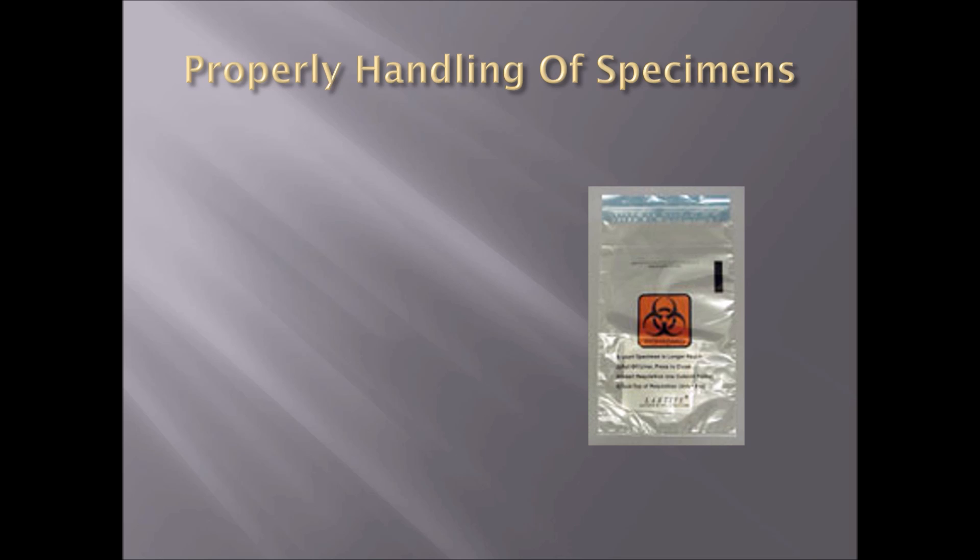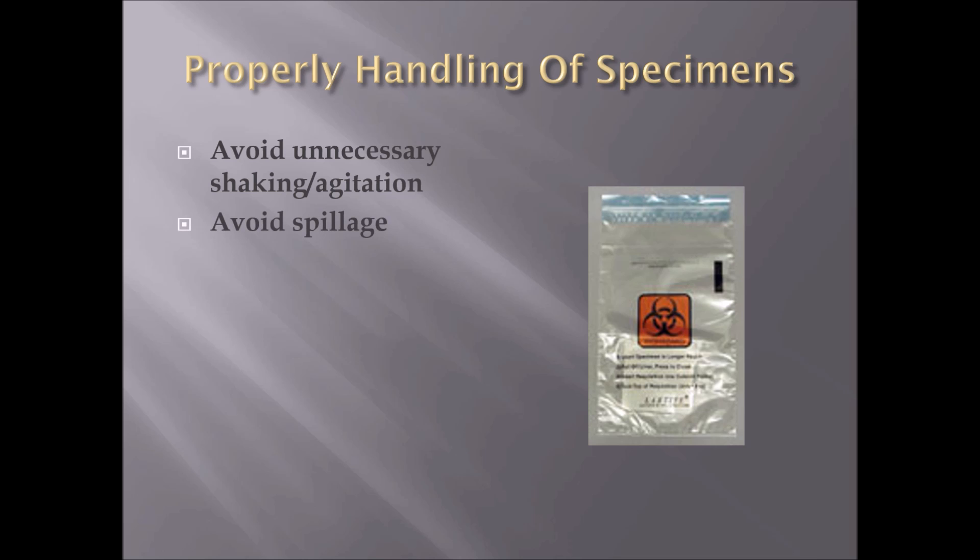When handling specimens, we will be putting them in a biohazard bag for shipping if you are working in an independent lab station. Avoid unnecessary shaking or agitation of the bag, as this can cause the blood cells to break — also known as hemolysis. We must also avoid spillage; make sure everything is sealed and contained tightly in the bag. Stoppers are always facing up — never facing down or sideways, to avoid leakage.